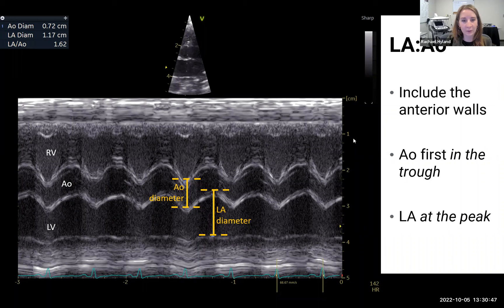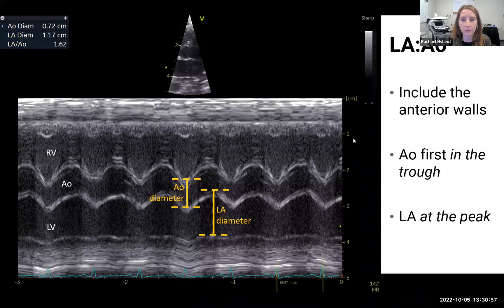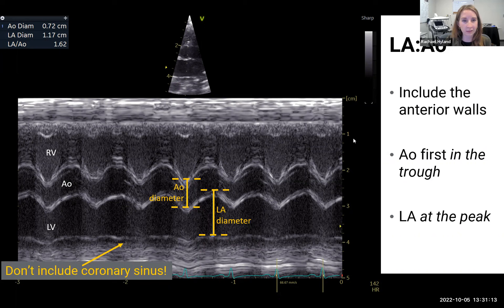In that same view, we measure the LA to AO using M-mode Doppler. For these diameters, you actually want to include the anterior wall of both — the AO measurement includes the anterior wall to the end of the cavity, and the LA includes its anterior wall to the end of its cavity. A common pitfall is mismeasuring the end of the LA — the coronary sinus sits just below, so make sure you're not including that in the LA diameter, as it will overestimate. We measure the AO at the trough and the LA at its largest diameter at its peak.